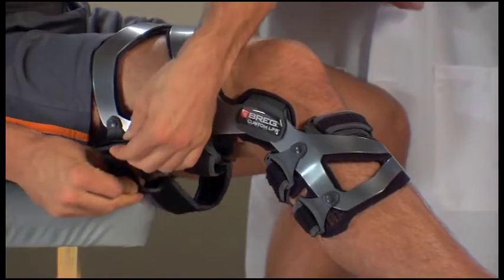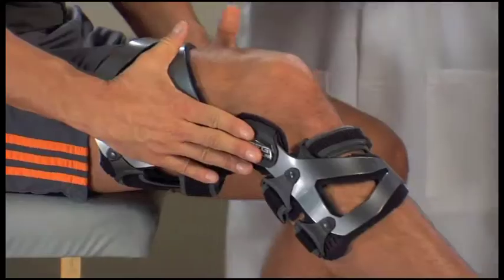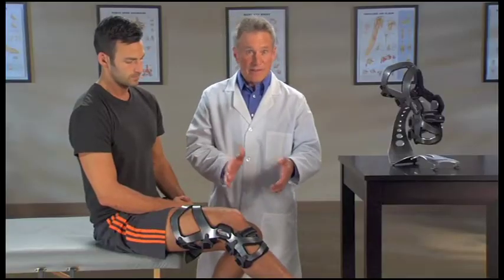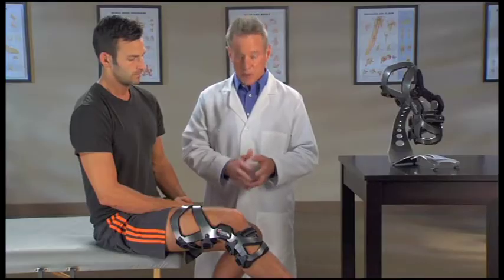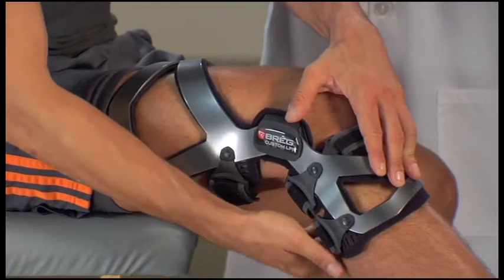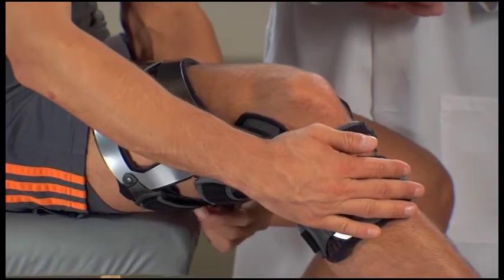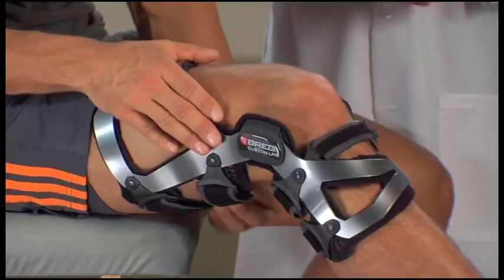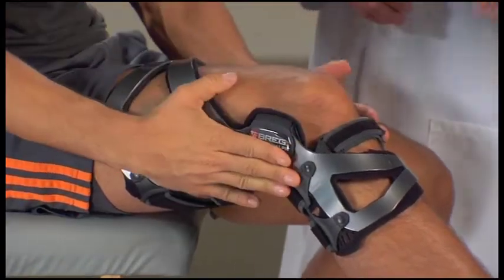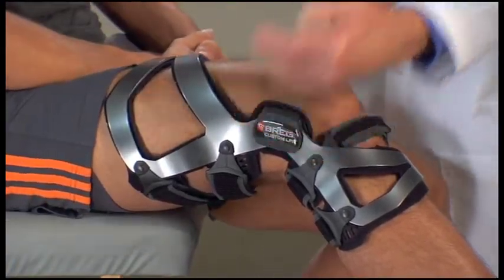After you've been active for a while — about five minutes or so — your body fluid levels will change, making your brace feel loose, so you'll need to retighten the brace straps. To retighten, sit with your knee bent at a 30 degree angle like before. Press the thigh and shin cuffs flat against the front of your thigh and shin. Loosen and then retighten each strap one at a time in the proper order. Remember to apply equal tension. Make sure the brace hinges align with the top of your kneecap and are at or slightly behind the midline of your knee.